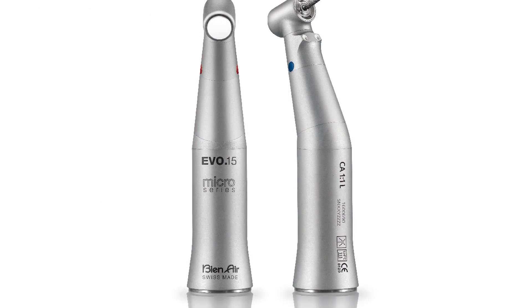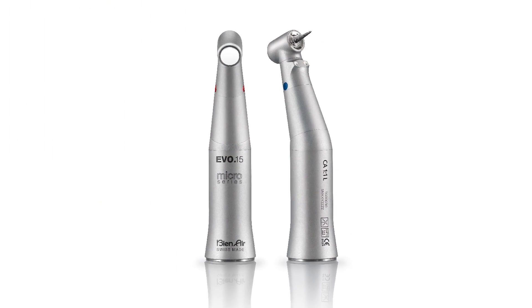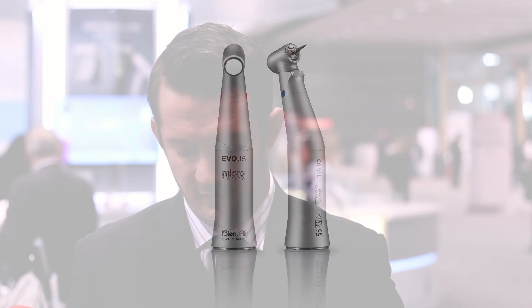There are a couple of innovations with the contra angle line Evo 15, the most important being the ceramic push button. Safety is sort of the concept we're going with here. The ceramic acts like a heat shield — this is the only handpiece tested not to elevate above human body temperature during operation. It's the safest one currently available, and it's connected to our MCX motor system. It's really small, compact, and powerful.